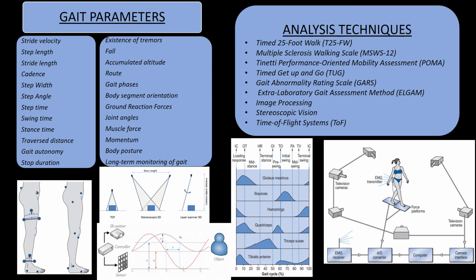Within image processing methods, one technique has become very important at the present time: depth measurement. It's also called range imaging. It's a collection of techniques used to calculate and obtain a map of distances from a viewpoint. This technique makes it possible to obtain important elements of the image with better and faster real-time processes.